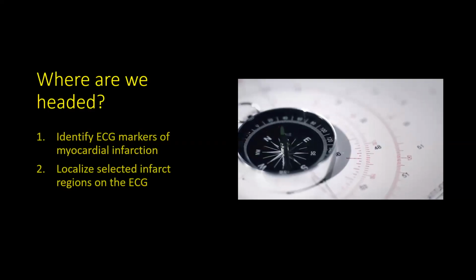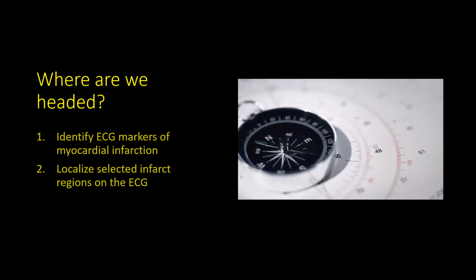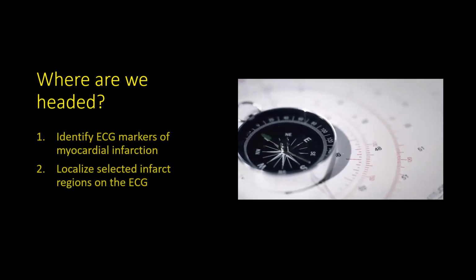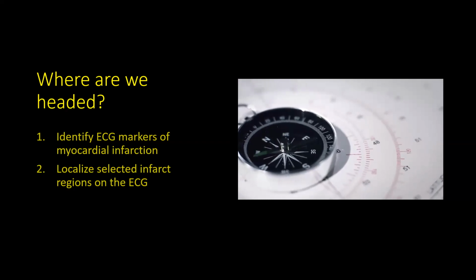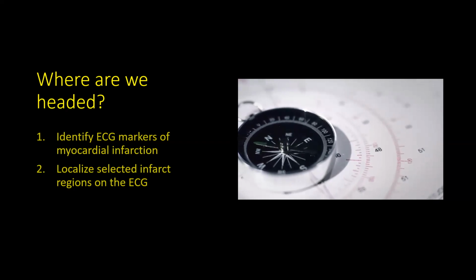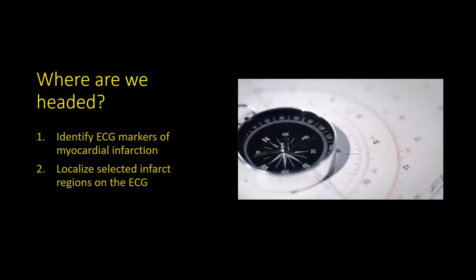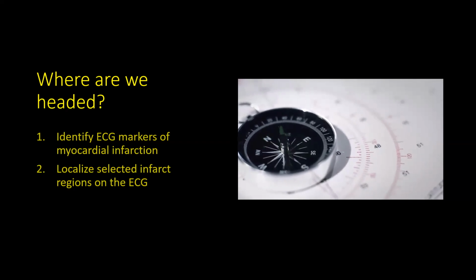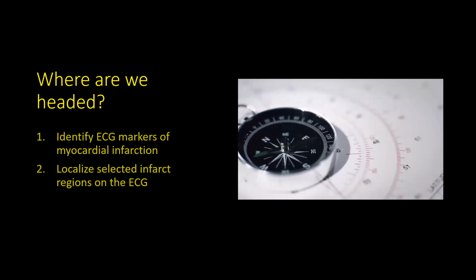So why are we here today? Well, we are here today hopefully to accomplish two objectives listed on the slide. These objectives were set because an expectation of the acute coronary syndrome, or ACS protocol here in the United States, is that healthcare professionals must obtain and interpret a 12-lead ECG on a patient within 10 minutes of presentation.